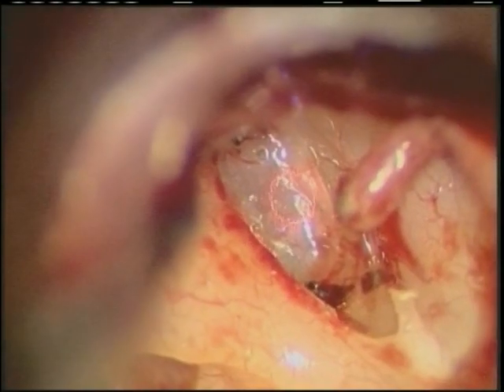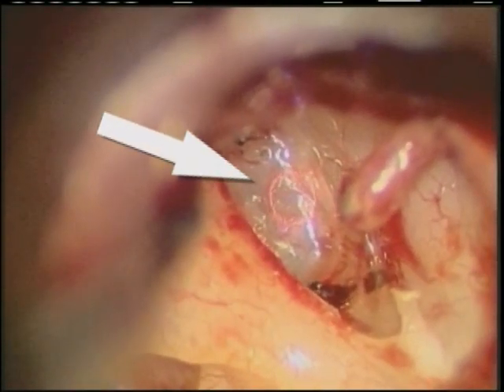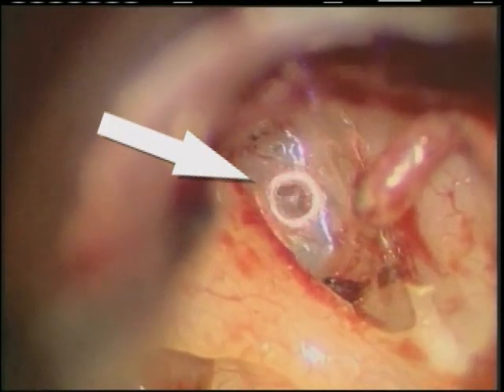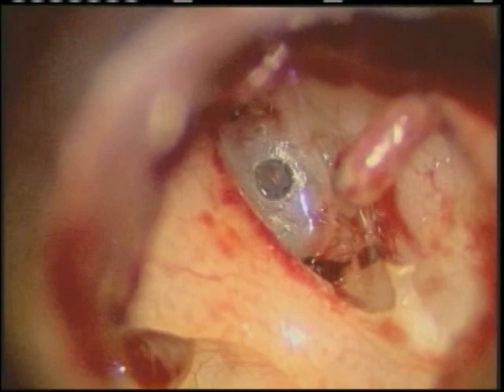Real case footage illustrates the simplicity of the procedure. Note the scanning fenestration diameter outline before laser treatment. No other treatment probes are obstructing the view.